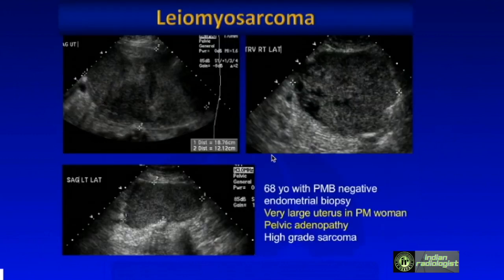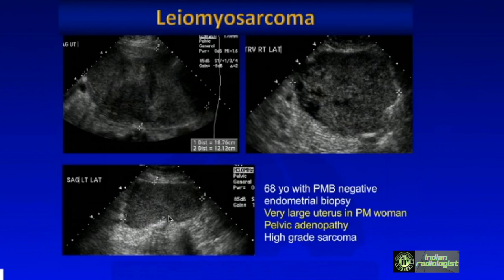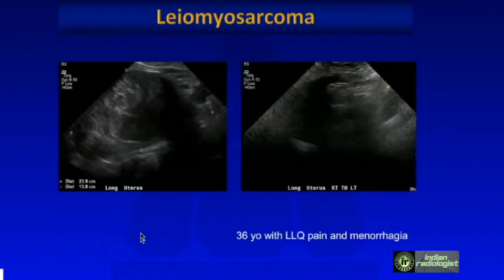This is a very large uterus — almost 19 centimeters — in a 68-year-old woman with postmenopausal bleeding and a negative endometrial biopsy (because the endometrium itself was not affected). She had a very large heterogeneous uterus, and additionally we saw a left inguinal region mass. That combination indicated very likely sarcoma, which turned out to be a high-grade sarcoma.